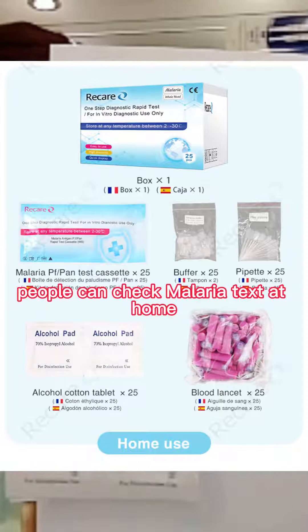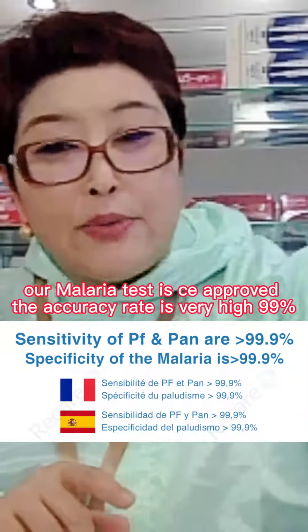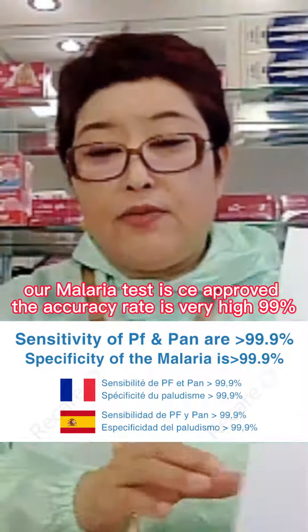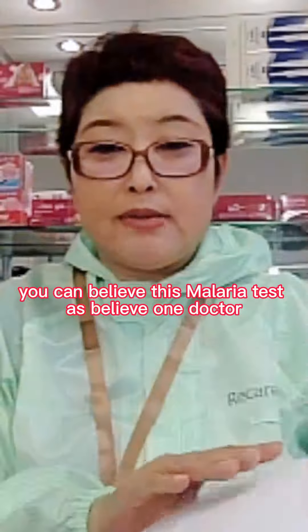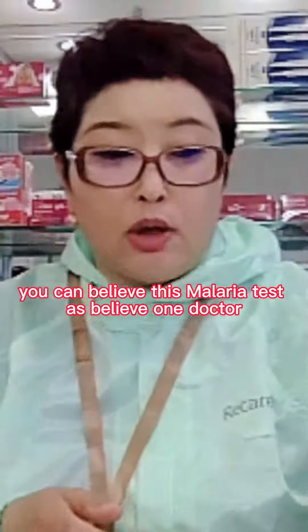People can check Malaria test at home. Our Malaria test is CE approved. The accuracy is very high — 99%. So you can trust this Malaria test.